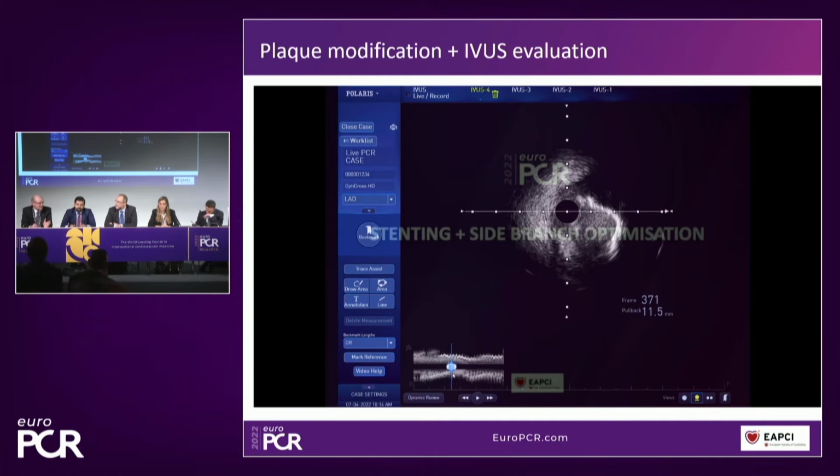And certainly for critical disease, I never start with them. If I think rotablation, it's rotablation. And I'll do that first and then see where I am. Yeah. Well, stay on that, because there is another specific indication where cutting balloon is great.